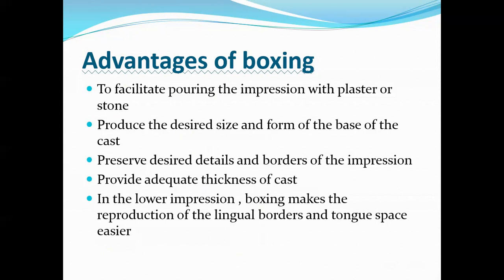What is the advantage of boxing? Why do we do boxing? First, to facilitate pouring the impression with plaster or stone. Second, produce the desired size and form of the base of the cast. Preserve desired details and borders of the impression. Provide adequate thickness of the cast.